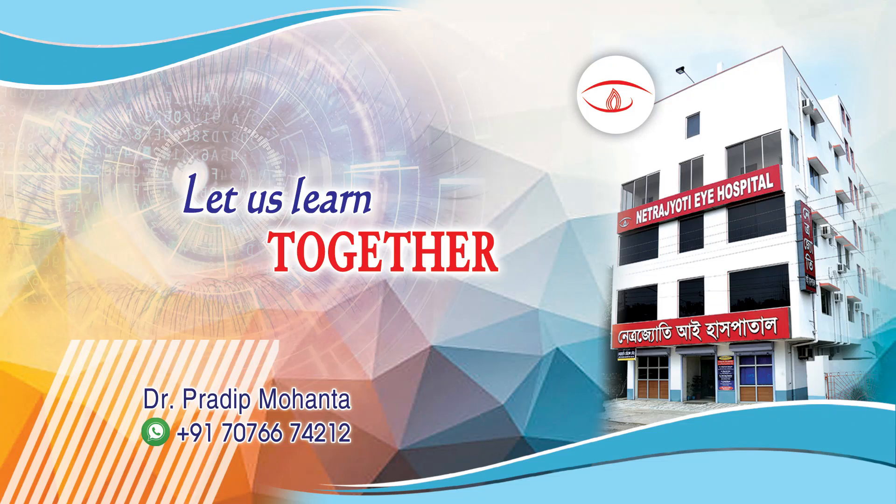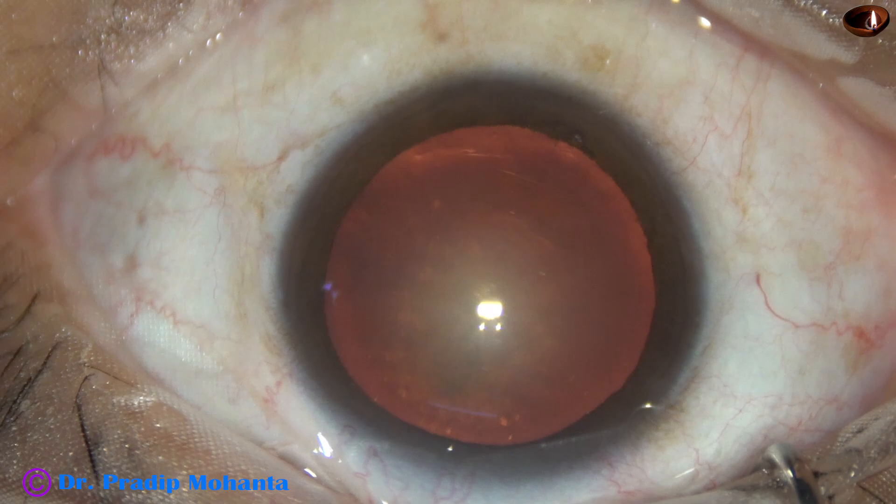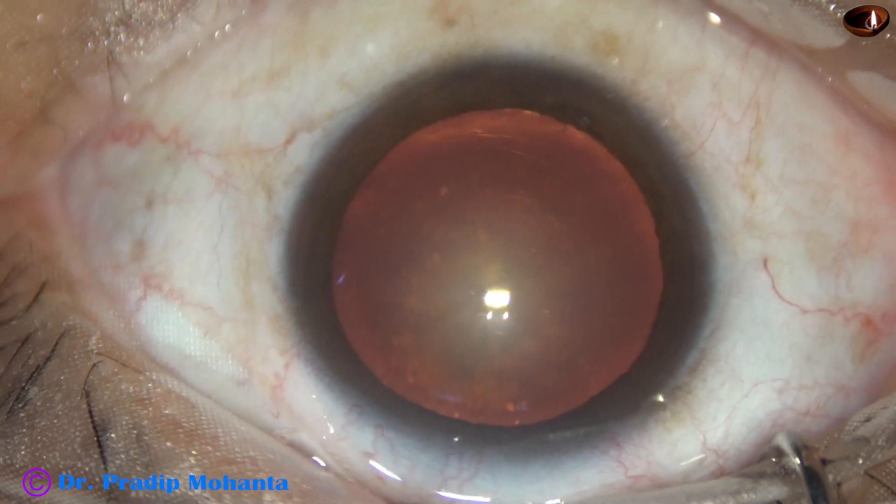Friends, welcome to my workplace at Ranak Heart, West Bengal, India. This is a posterior subcapsular cataract. Nuclear sclerosis is about grade 2. Let us observe this surgery.